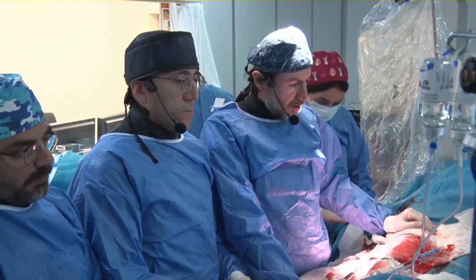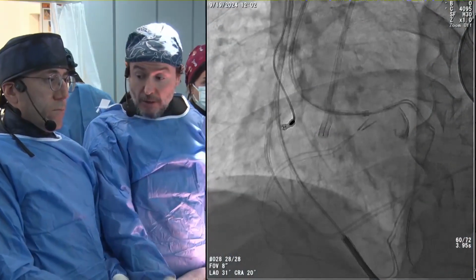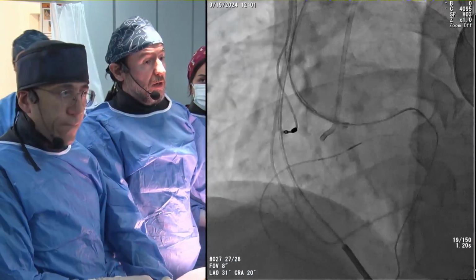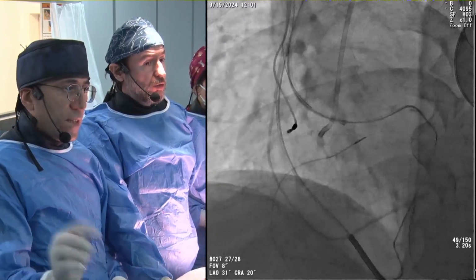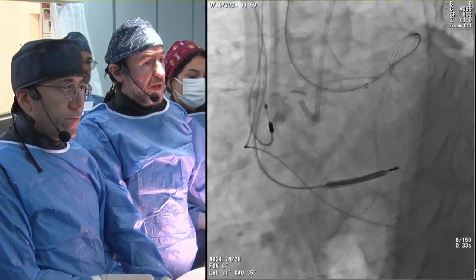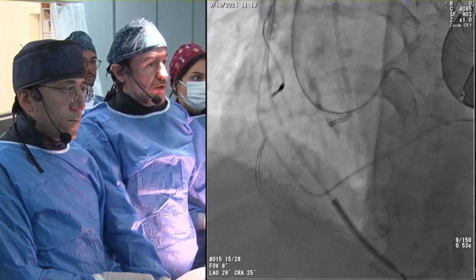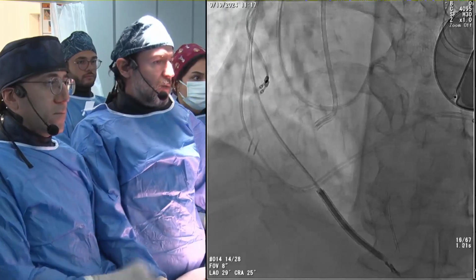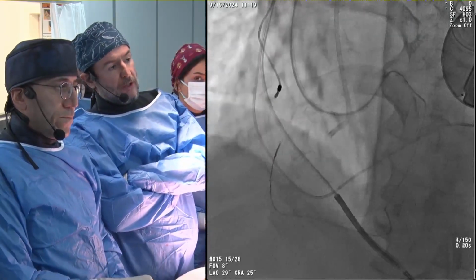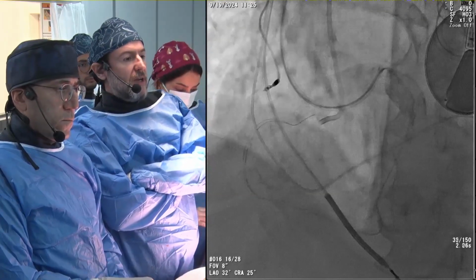So, luck is on my side this time. So, show us, guys, where we left you. Go back. Oh, you are into the aorta. I hope so. Wow. So next one. Wait. Okay. Yep. So this was the Hornet.